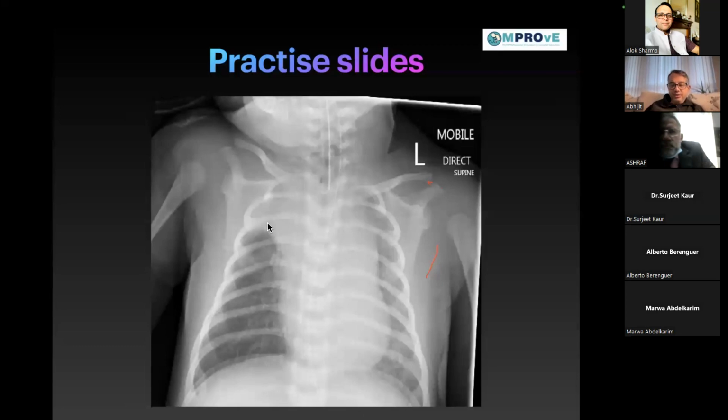What do we do next is the question. Ultrasound. Right. Lung ultrasound to differentiate collapse or atelectasis from consolidation. Yes. So if you don't have a lung ultrasound, what would you have done? Restrap the tube, push it a bit downward. And then re-X-ray, put the tube down, right side up of the baby, nursing, and then re-X-ray the baby.